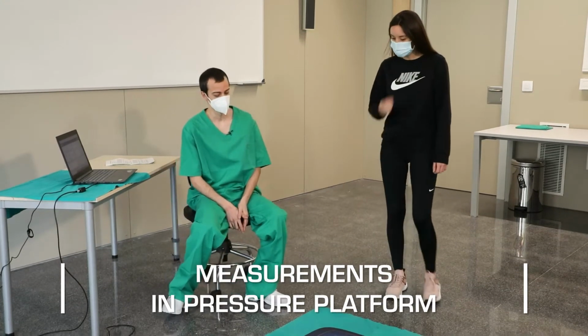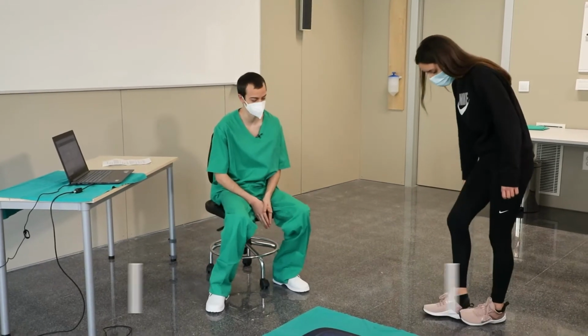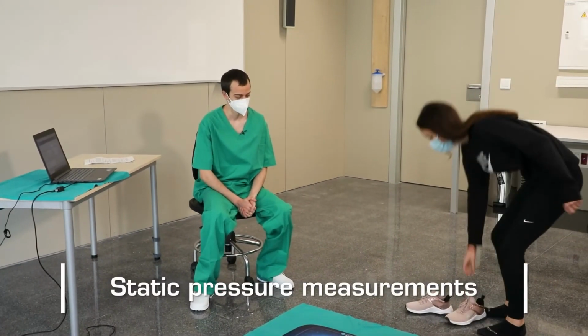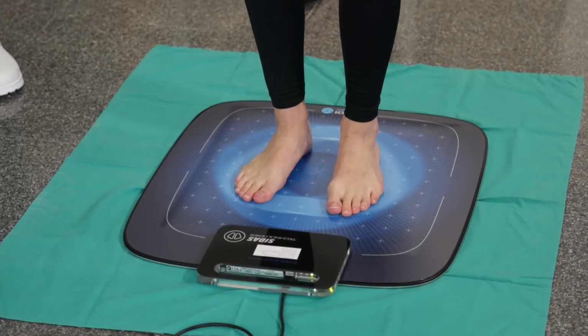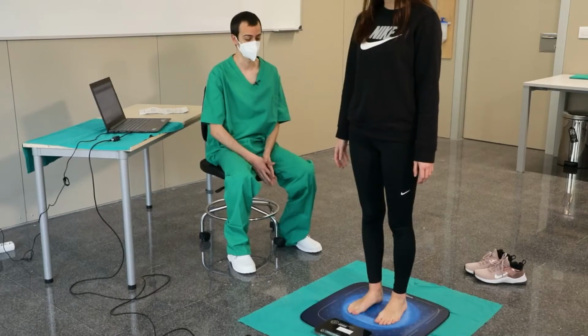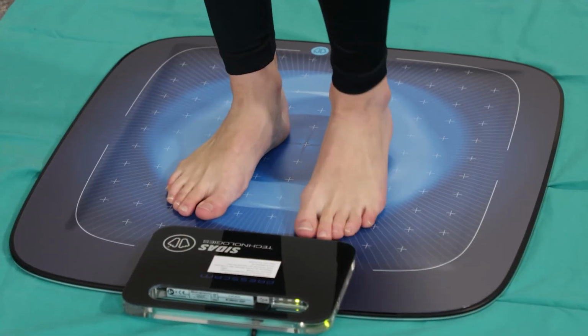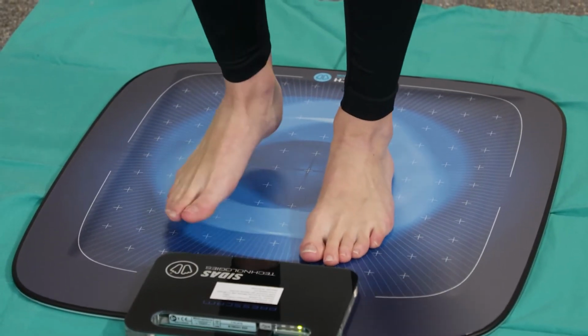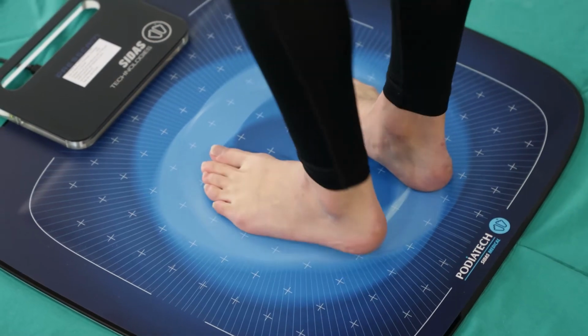The professional asks the patient to take off his shoes and socks. To take the static measurement, the patient is asked to position himself in the center of the pressure platform, look straight ahead with his arms extended along the body, and stand without displacement. All this is done to achieve a physiological position of the individual and to avoid the measurement being falsified. Once this is done, we will take the pressure measurement.